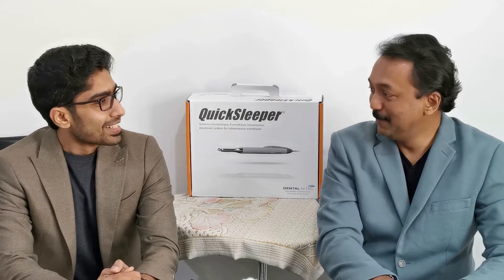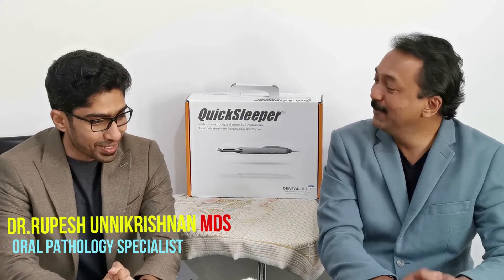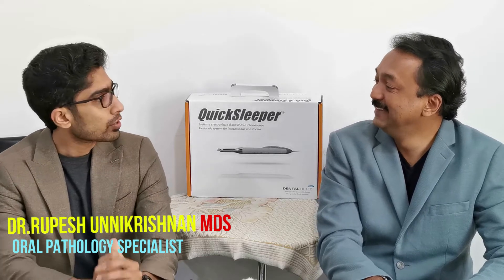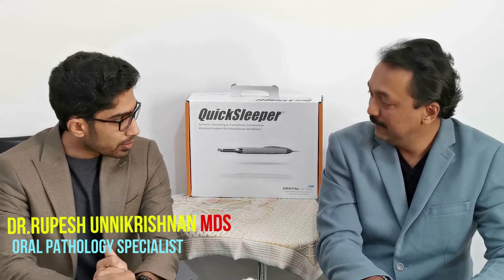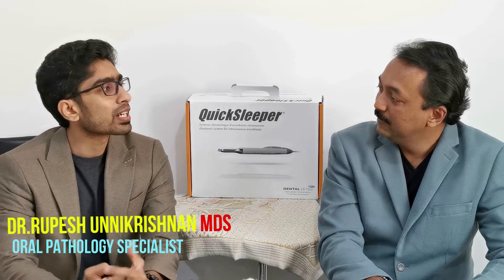Welcome Dr. Rupesh to this episode. Thank you so much. Thank you for having me. Absolutely. Okay so what are we going to do today? Today we are going to be doing the assembly of the Quick Sleeper device as well as a small demonstration of how the device functions.